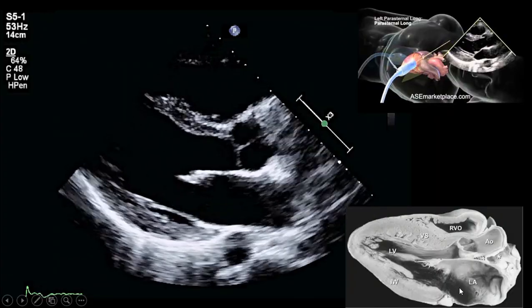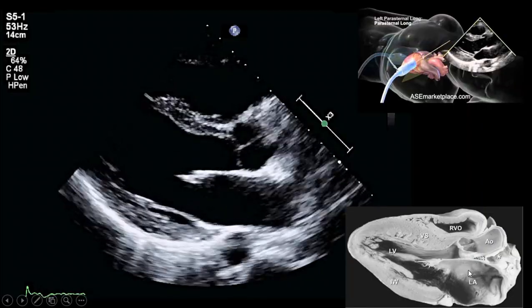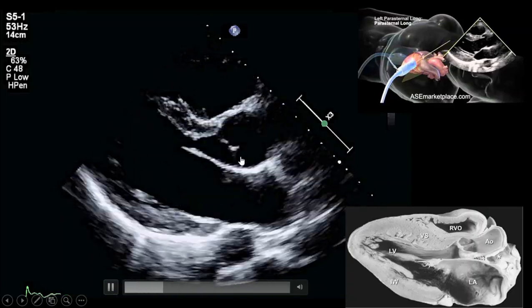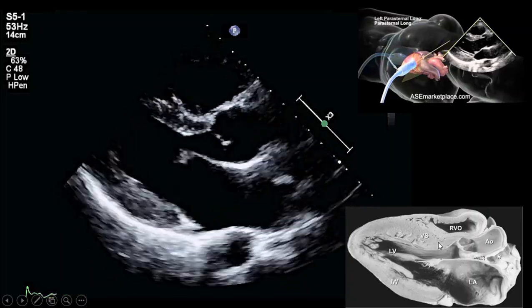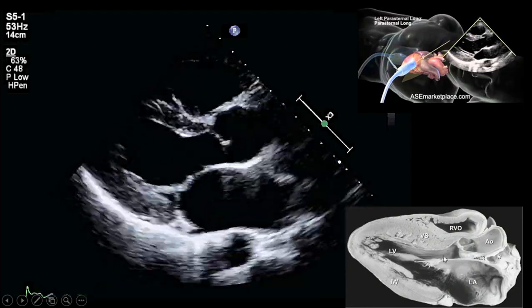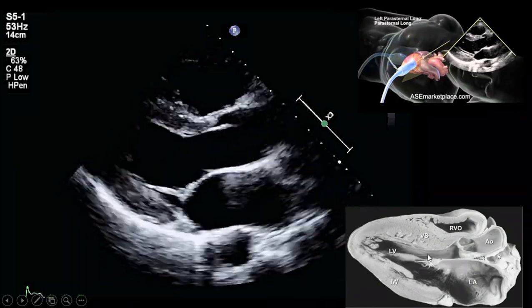In other words, the camera creates an image in the depth dimension, or z-axis, but ultrasound only creates it from the cutting surface, not the depth dimension or z-axis.